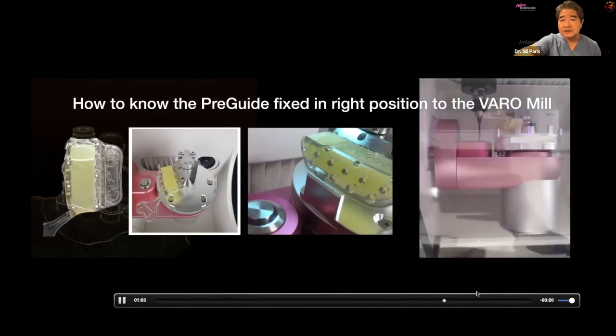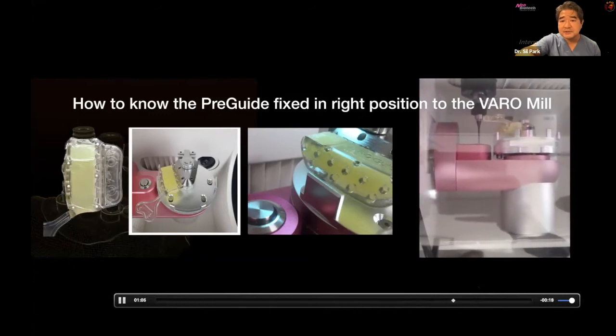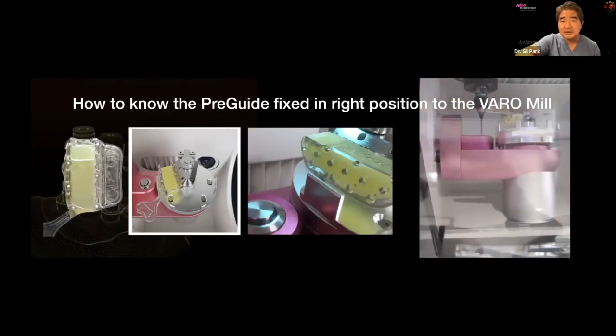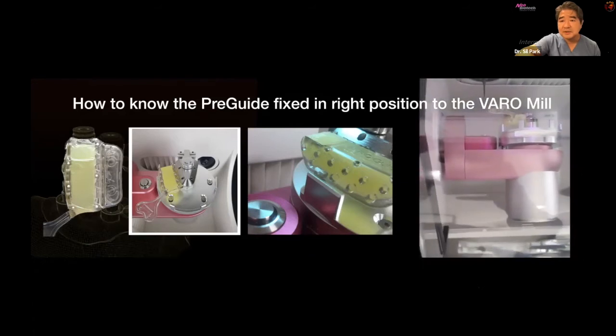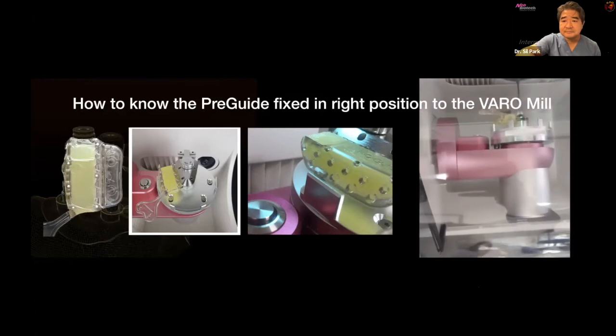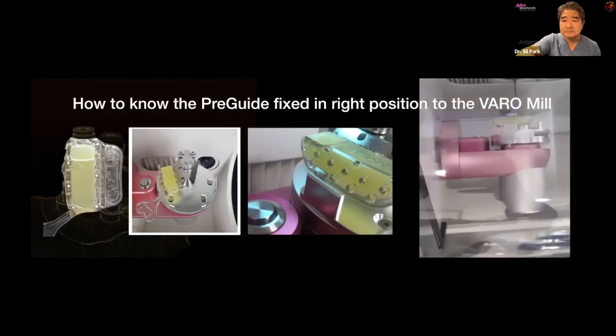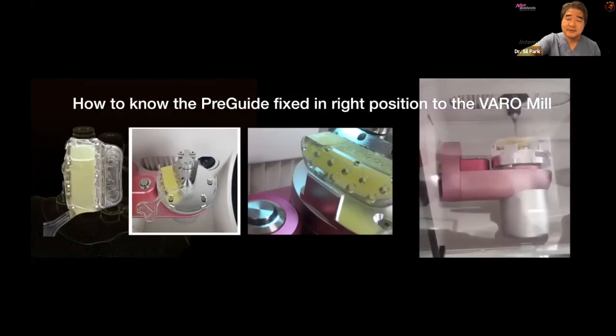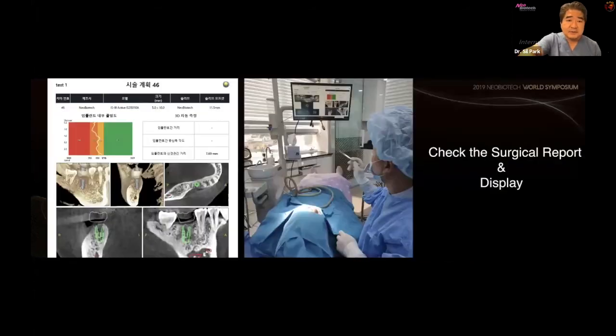So that is the zero point calibration done. Once the machine has self-calibrated and confirmed the position, it begins milling your guide. As you can see, all right. Okay, so let's move back.